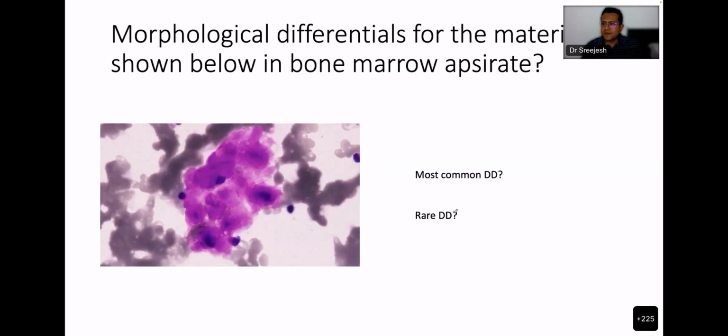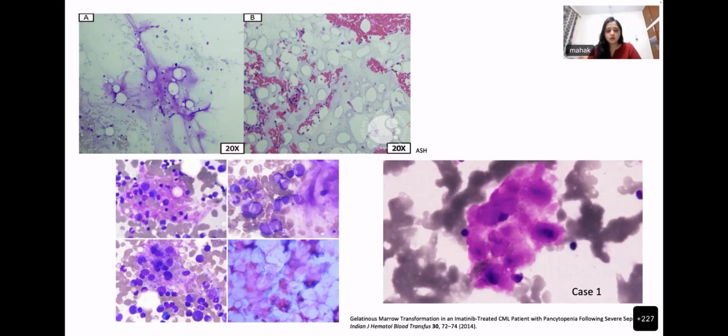Okay. Just before completion, other differential diagnoses for a material like this, quickly. So gelatinous transformation of the bone marrow. The quality is a little different. See, this material and this material are usually different. So you should know. Sometimes if this gelatinous material is thicker and more pinkish, you can get it, especially in patients who are malnourished or on chemotherapy. The plasma cells also will be seen frequently. In that situation, you should not confuse this.